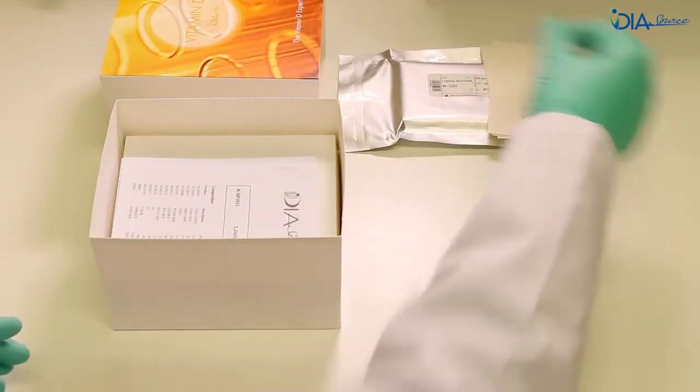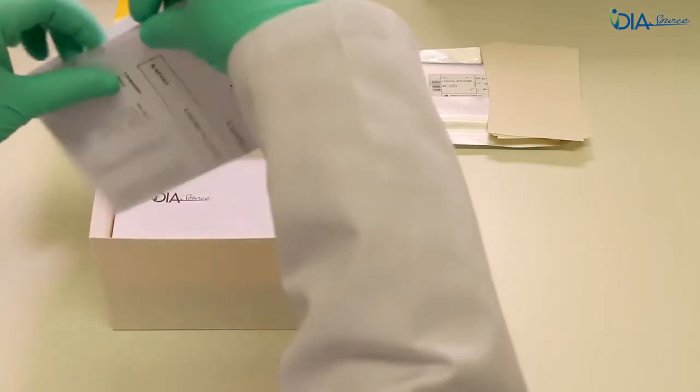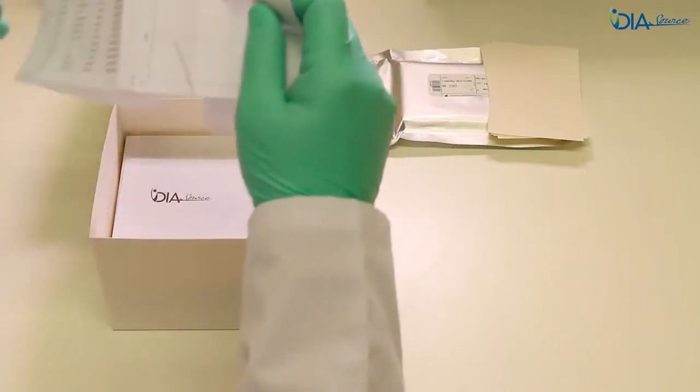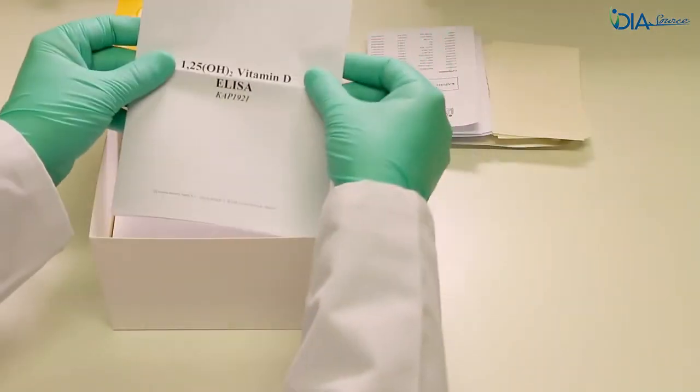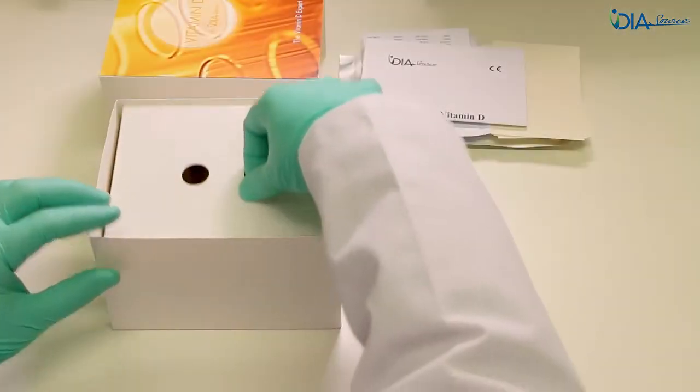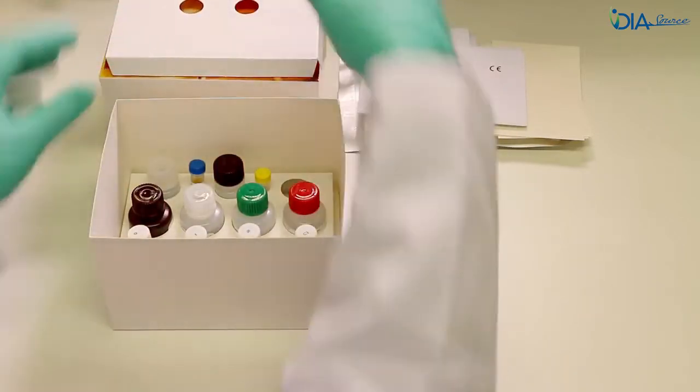The assay uses organic solvents. If the user has no access to high quality solvents, Diasource can supply an extraction kit that contains all the necessary solvents to perform the extraction step.